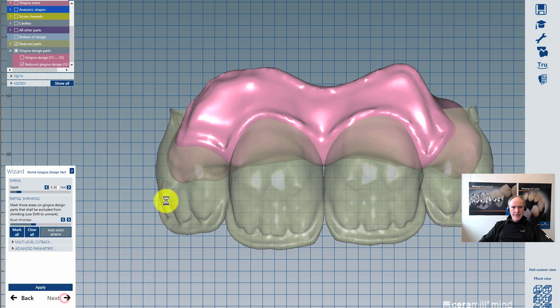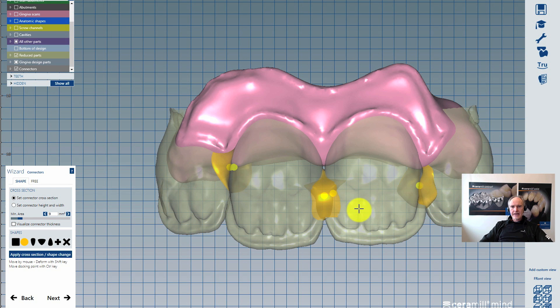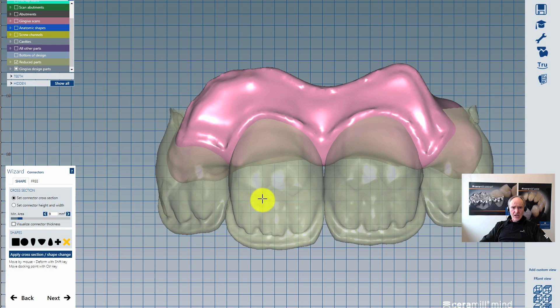Click next, and now we get the connectors. In this case I don't want to have any connectors at all. I click this new button here — it deletes the connectors with one click. On apply, they are gone. Of course we don't need connectors in this case. With a click on next, we now get the first merging of the elements.